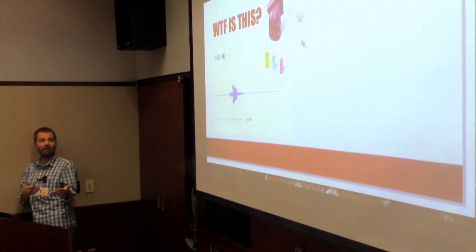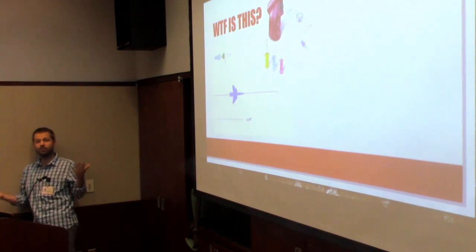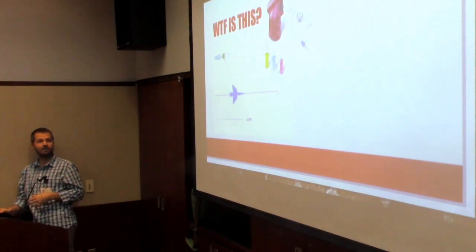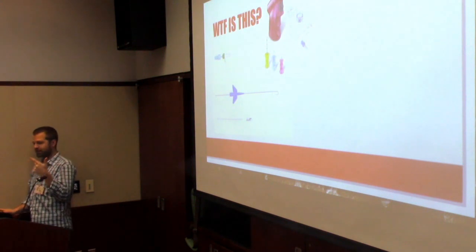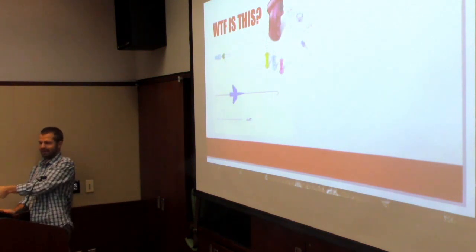Do I have to switch sides? Crap, I don't have any more yellows. So now what do I do? I need to go find a different part of the body and use the blue and see if I can find a skinnier part of the person. But that hesitation where you stand there with the drill and you're like, I'm not sure, do I just go? Is it kind of like here?